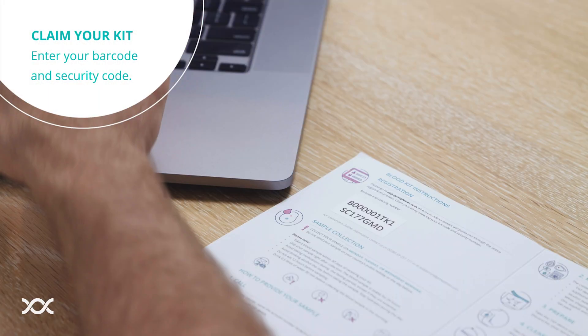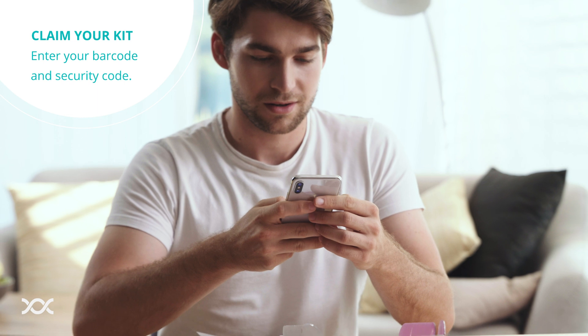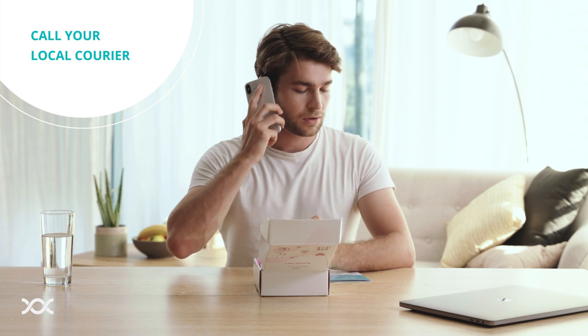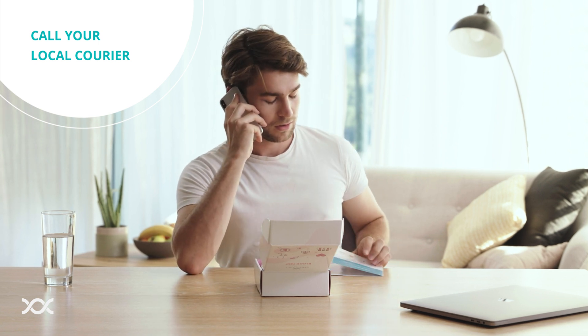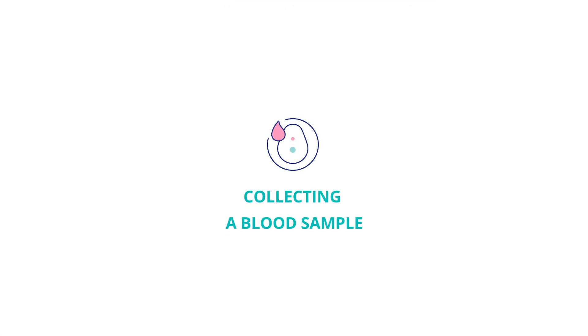Enter your barcode and security code found on the instructions leaflet in your kit. Before you start blood collection with the TAP device, call your local courier, name the account number 953-829-196, and arrange a pickup. When the pickup is confirmed, you can collect a blood sample.